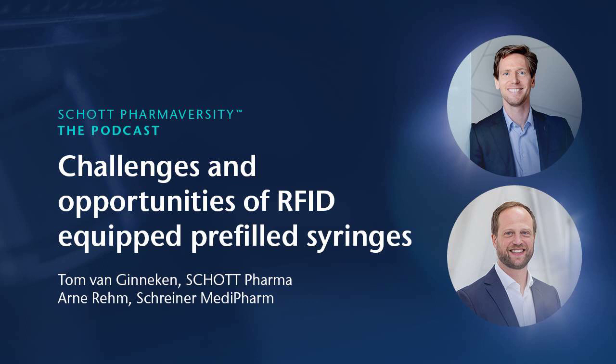So yeah, it really is important to understand that the use of RFID for pharmaceutical products is anything but simple. Although the technology itself is quite mature and robust and old, as already mentioned, many attempts of using RFID in the past on a large scale for pharmaceutical products really failed due to the technical feasibility. And also, not to mention the cost aspects in the past as well.